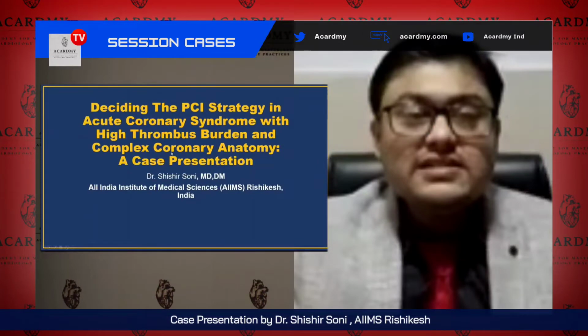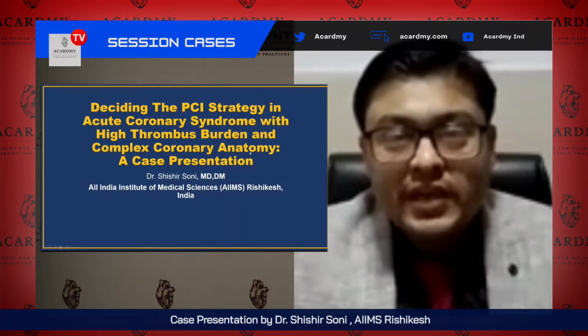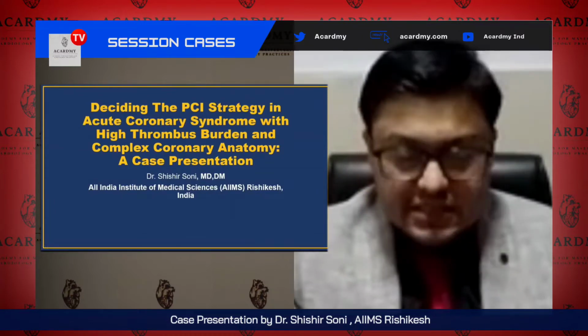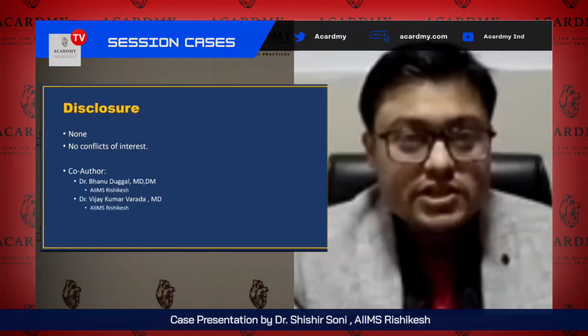I'm presenting a case titled Deciding the PCI Strategy in Acute Coronary Syndrome with High Thrombus Burden and Complex Coronary Anatomy. This is a case presentation by myself, Dr. Shishir Soni from AIIMS Rishikesh.